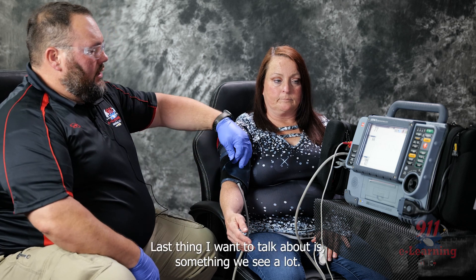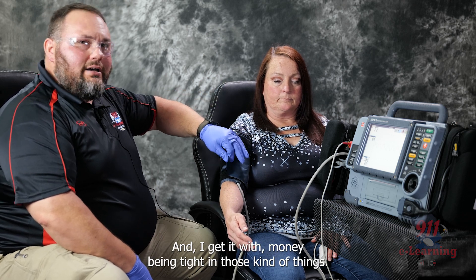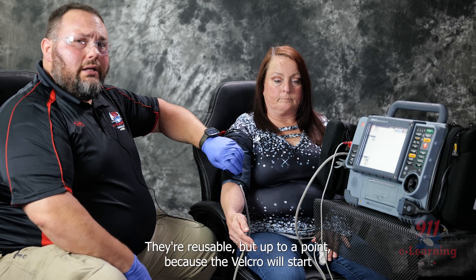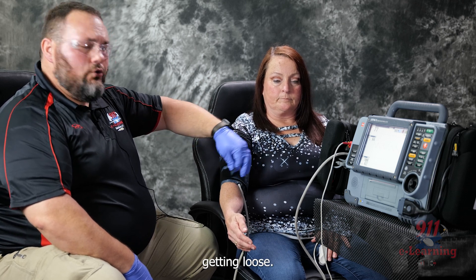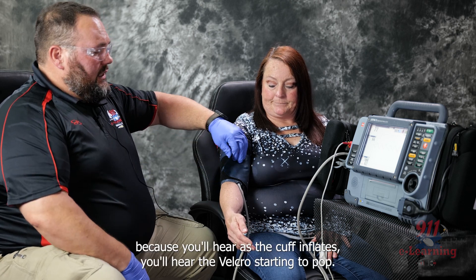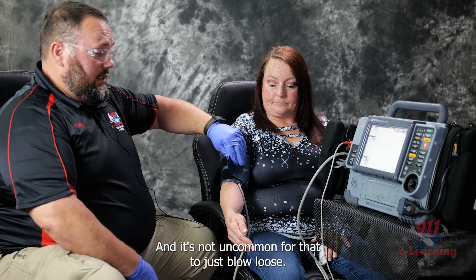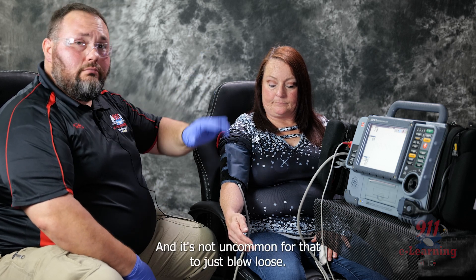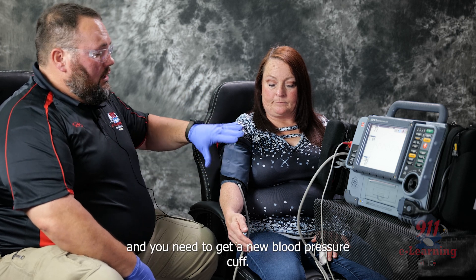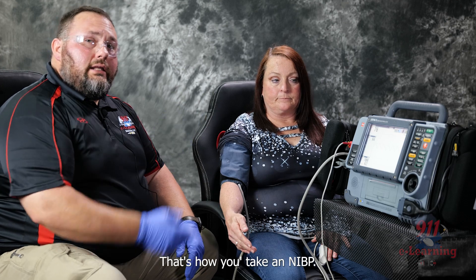One last thing — reusing these cuffs. They are reusable, but only up to a point, because the Velcro will start getting loose. When that happens you'll start getting bad readings — you'll hear the Velcro starting to pop as the cuff inflates, and it's not uncommon for them to just blow loose. At that point, that cuff needs to be thrown away and you need to get a new one. But that is the NIBP and that's how you take an NIBP.